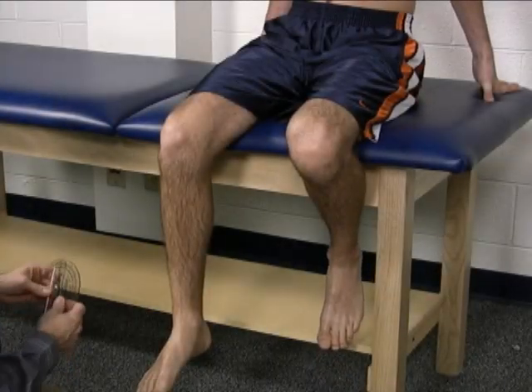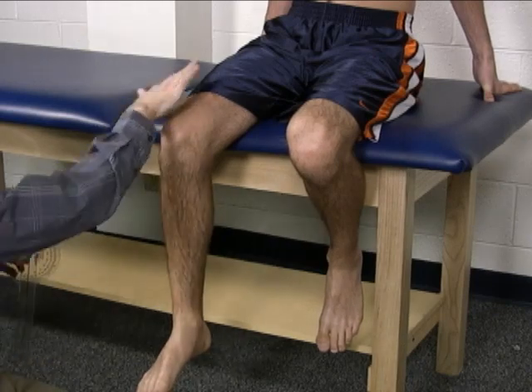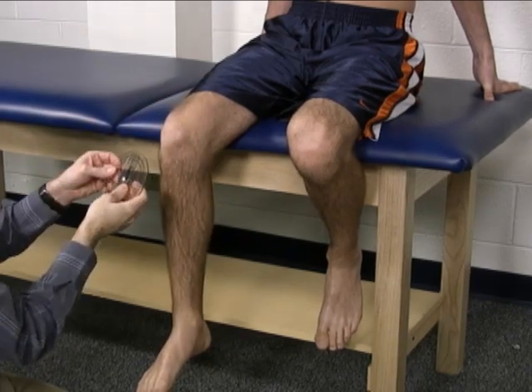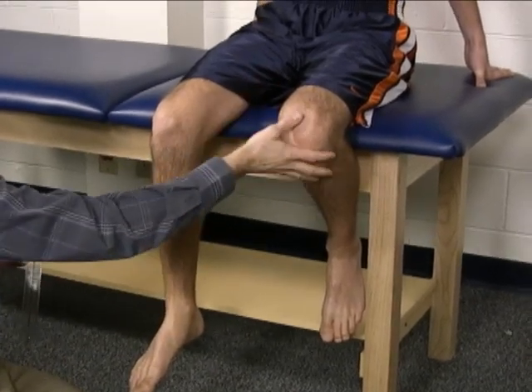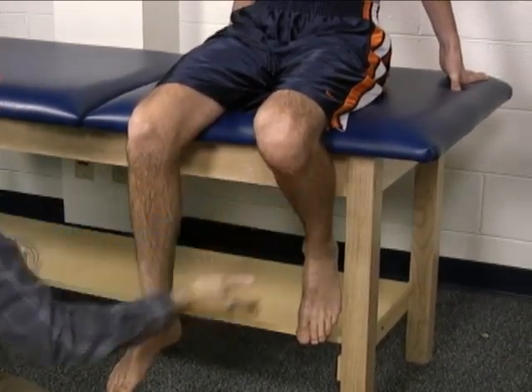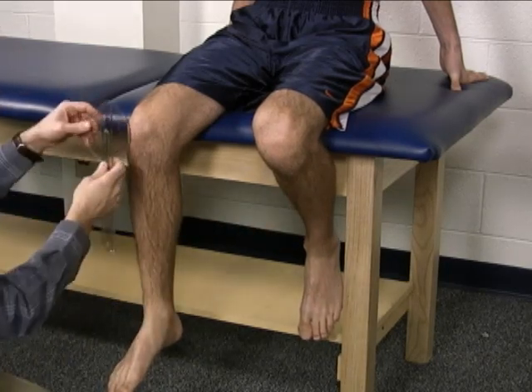To measure external rotation at the hip joint — external or lateral rotation of the femur — the patient is seated on the table. The contralateral leg is simply flexed underneath at the knee to keep it out of the way.